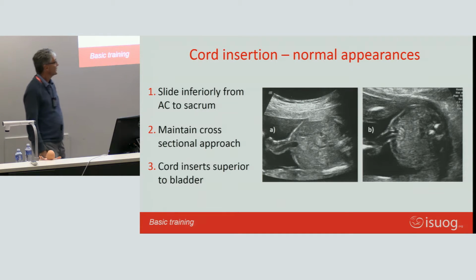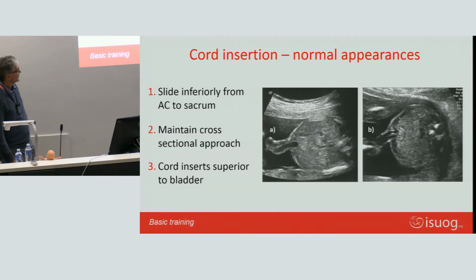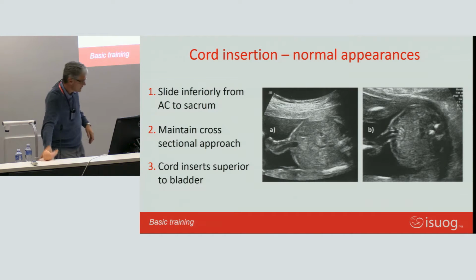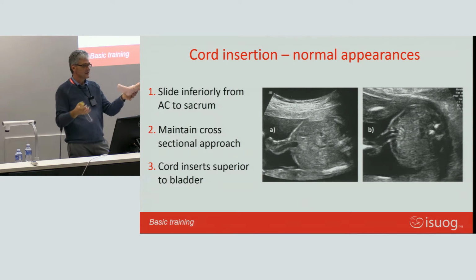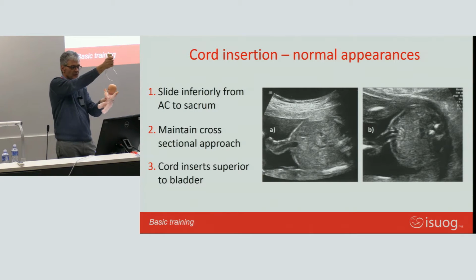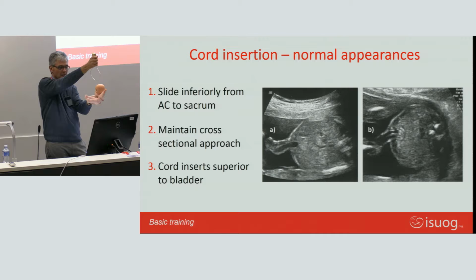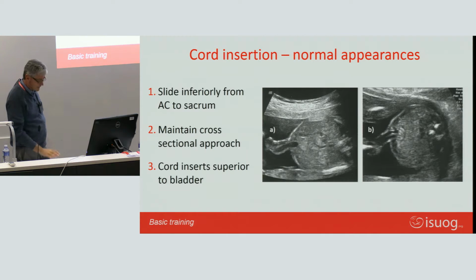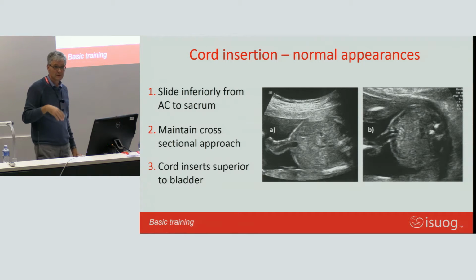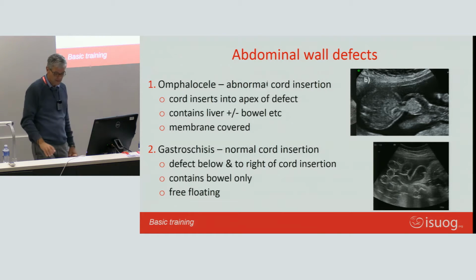Okay, umbilical cord. Right, so we're still scanning nice and, where's my scanner? Nice and cross-section through Poppy, and of course Poppy isn't lying straight, so if you go transversely, you start off coronally, go axially and end up coronally again. So actually I have to follow little Poppy's outlines. But anyway, here we've reached the umbilical cord. And now usually they say the umbilical cord is above the bladder, and that should be the case. If it's not, then there's something funny happening.